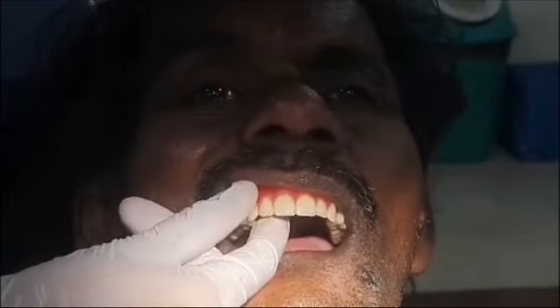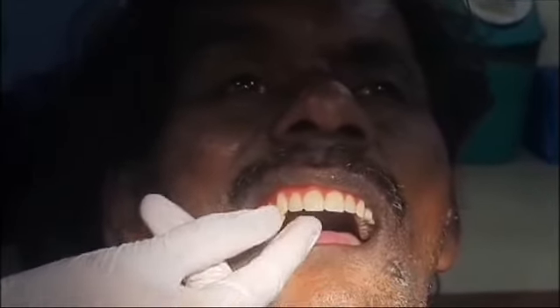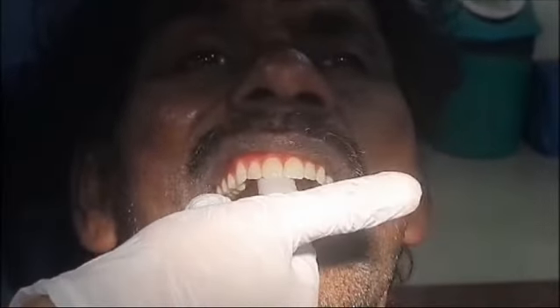Retention. Retention is evaluated as follows. Trying to pull down the denture vertically by holding the denture in the incisor region using thumb and forefinger. To check retention in the posterior seal area, the forefinger is placed on the palatal surface of the upper anterior teeth and an outward force is applied. Applying upward and outward force on the canine region to check retentiveness of the denture in the maxillary tuberosity and pterygomaxillary notch region of the opposite side.